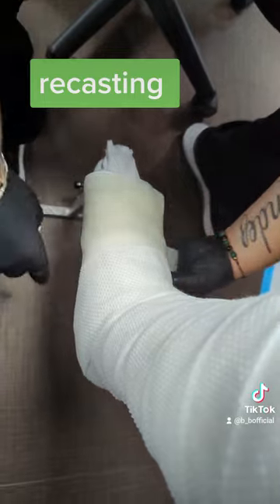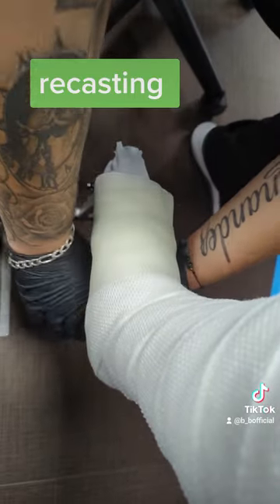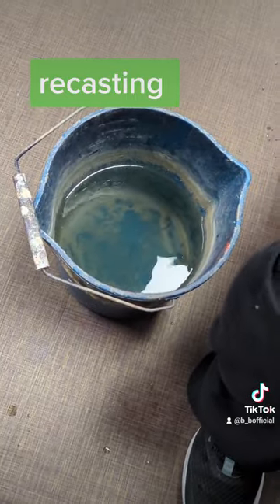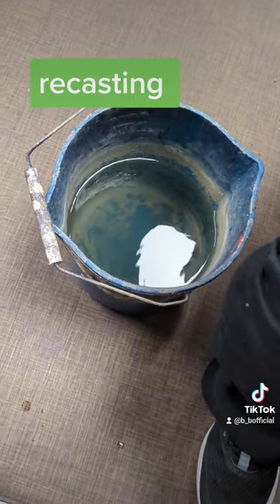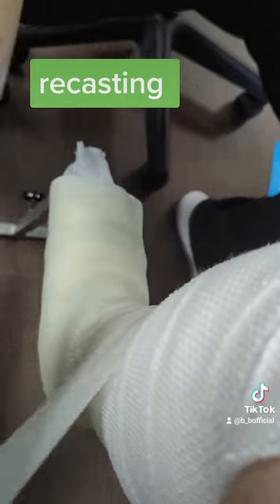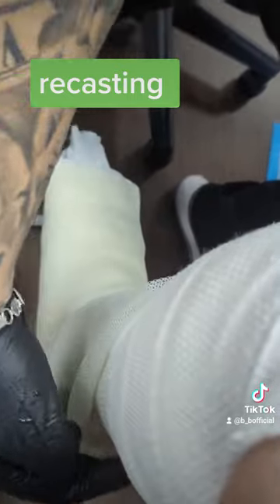What he's putting around me now is the physical cast. He had to get it wet in order to put it on.